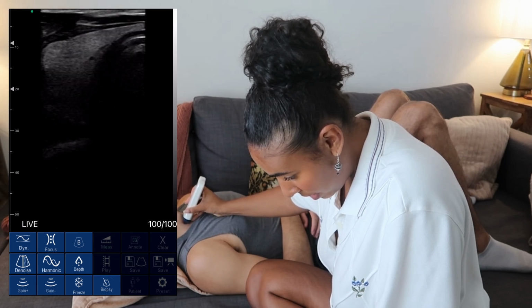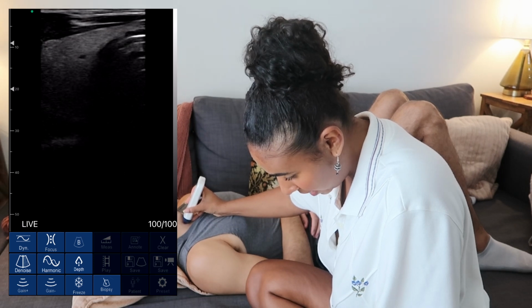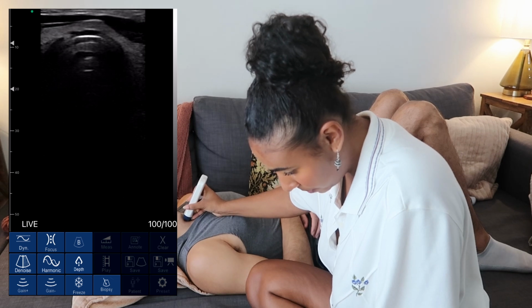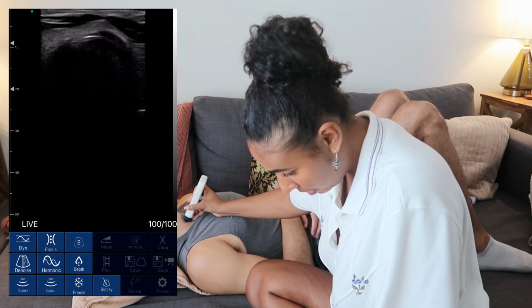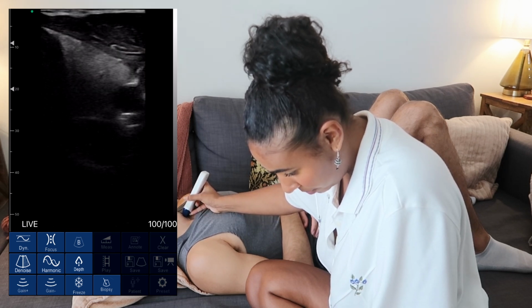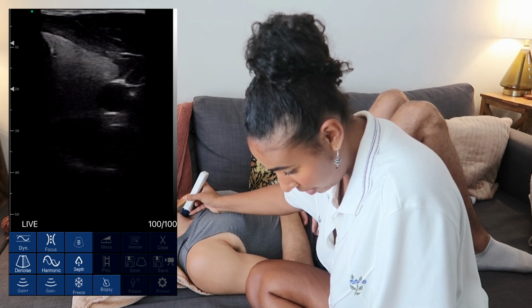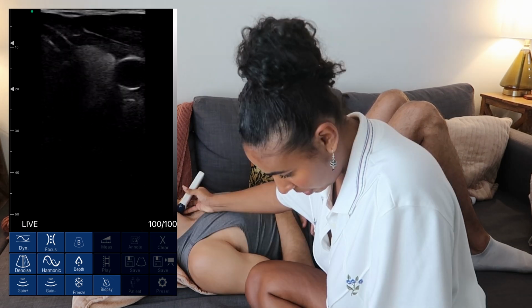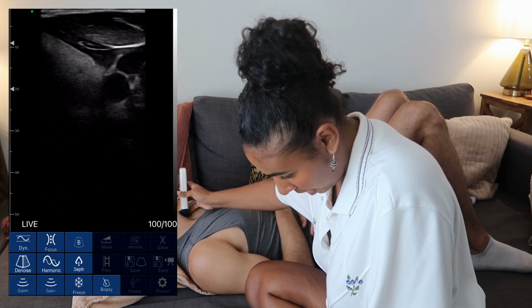And then here at the mid-level, we can also see the isthmus, which is like the bridge that connects the right and the left. And if I move more medially, now we're at the isthmus. We can scan superiorly and inferiorly on that. And then we're going to go to his left thyroid. We can see his jugular vein and his carotid artery as landmarks on the side there. We're going to again sweep superiorly and all the way inferior.